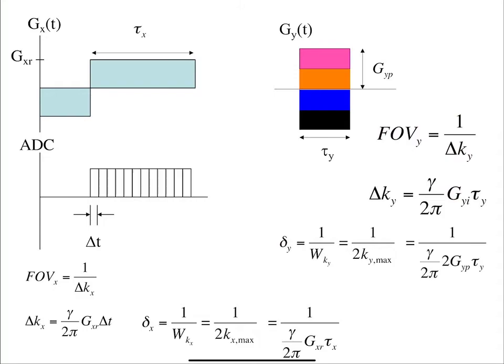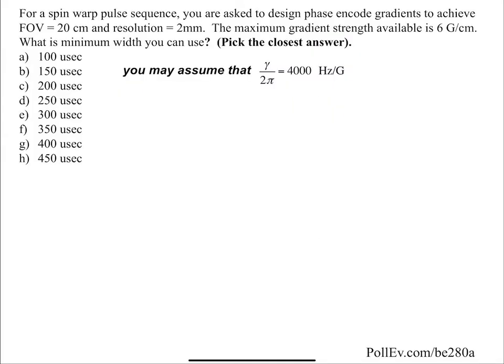Great. So this is just putting it all together. Unfortunately, as I look at this, it's a really busy slide, but let's just work through it. Given a general, well, let's actually have you do this problem first. Because we just talked about phase encode gradient, while it's fresh in your mind, now you're doing a phase encode gradient, and I'm assuming this doesn't have an error in it, but I will check as you're doing it. So go ahead and take a look at that.